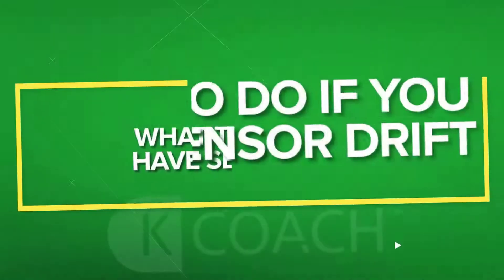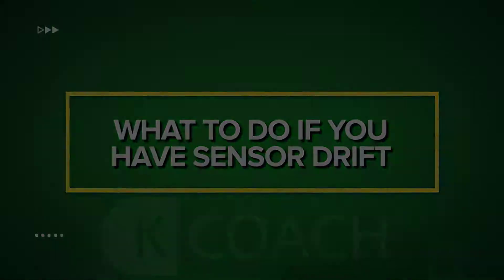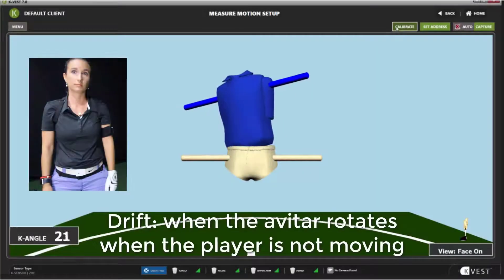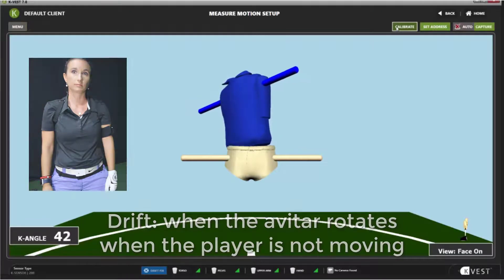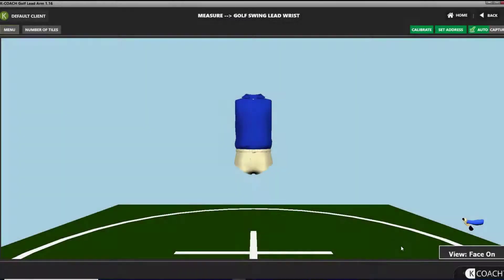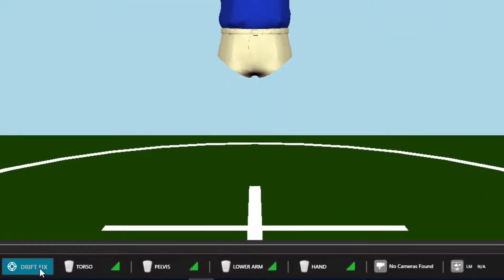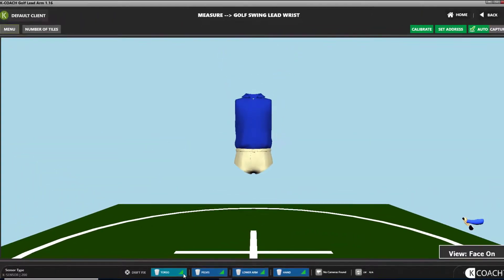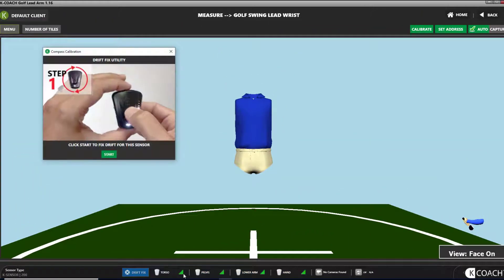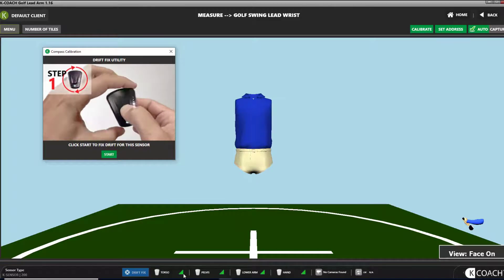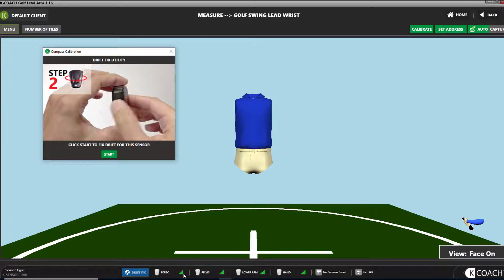What to do if you have sensor drift? At the bottom of every screen is a slider labeled KCoach. Click on this slider and you'll see a button labeled Drift Fix. If one of your sensors is drifting, click on the blue Drift Fix button and follow the instructions.